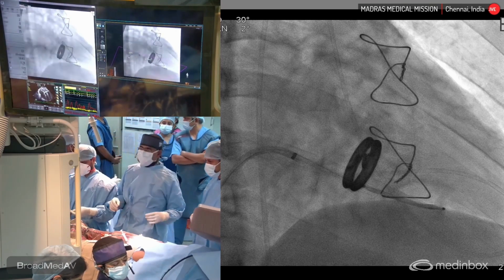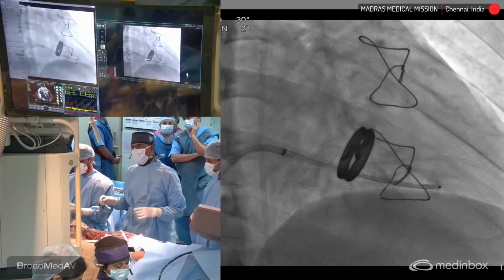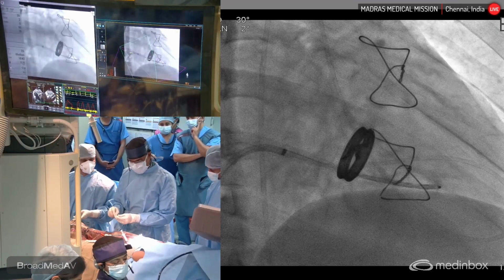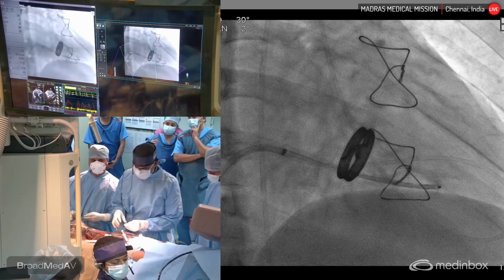There are quite a few ectopics. The moment I get my retrograde vascular plug, this is flushed, Pramod? Yeah.